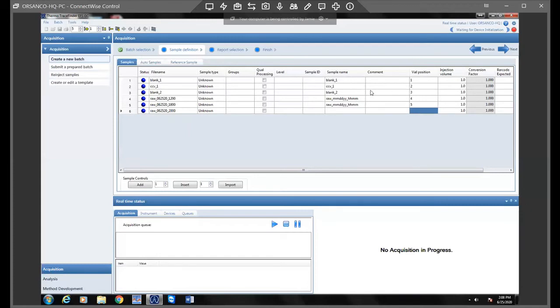The sample name does default there. You don't necessarily have to have that populated. It doesn't matter; we used to use it for something, but now we don't. So it's not that important that those are actually filled in. But normally we would just put the same value, but I'll just leave it for now.